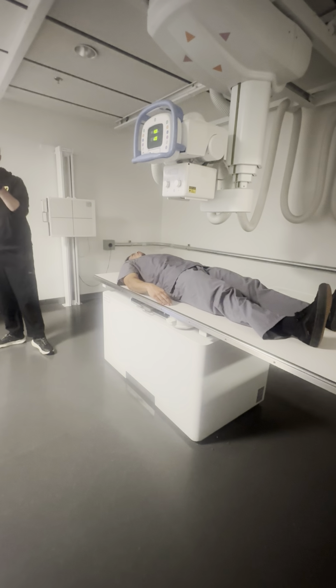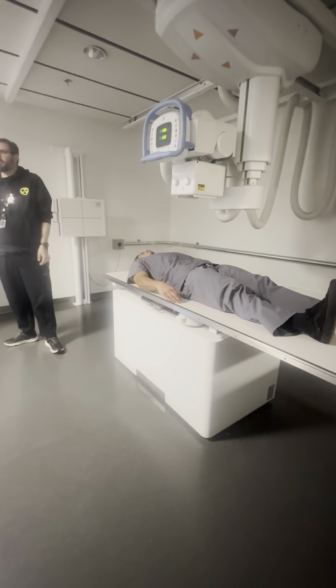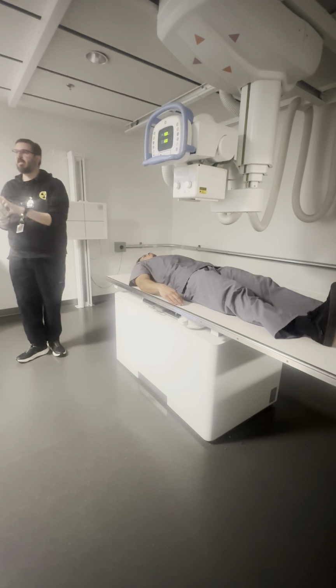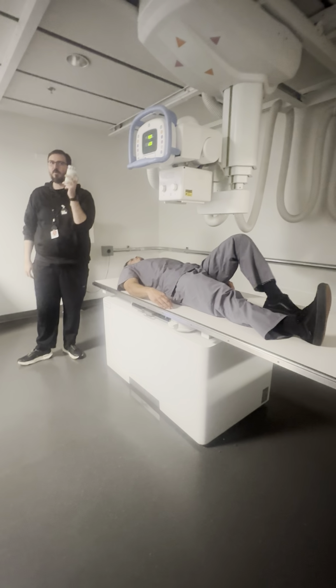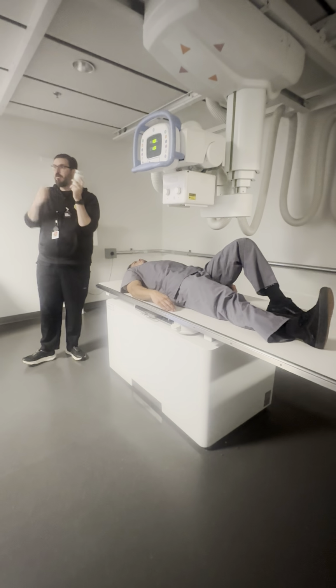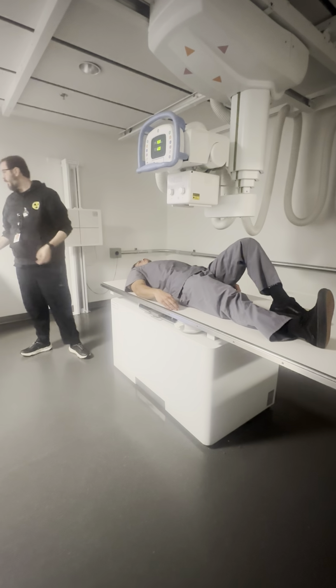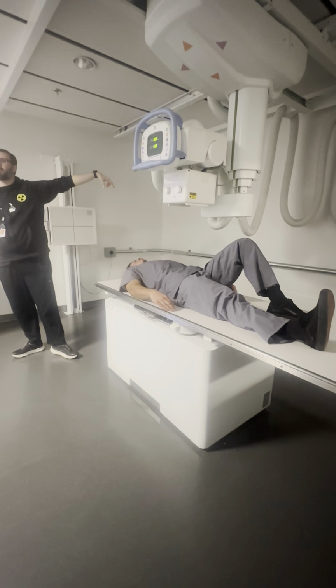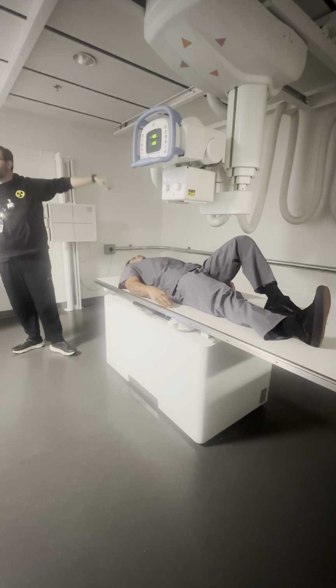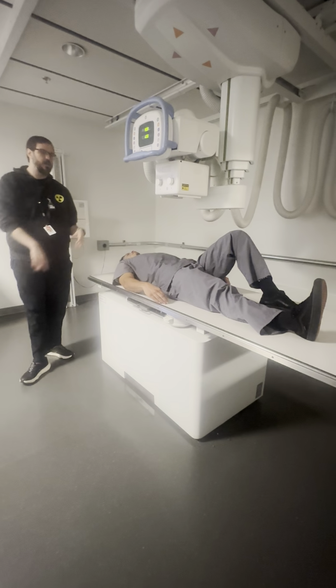Because I'm giving him 2 big cups of this. Most of your small bowels are 2 of these, or if you're using Gastrografin, it's 2 cups mixed with water. That's a lot of fluid to go missing. It has to have gone somewhere, right? This is why if you just jump to your delay at 30, you might miss the fact that they refluxed a bunch of it back up out of their stomach. So you kind of have to play it by ear.